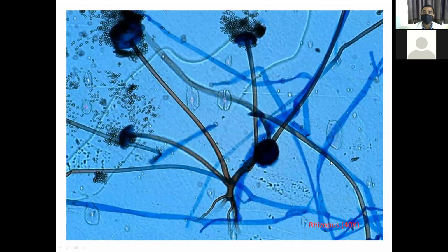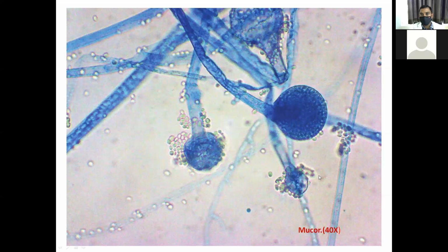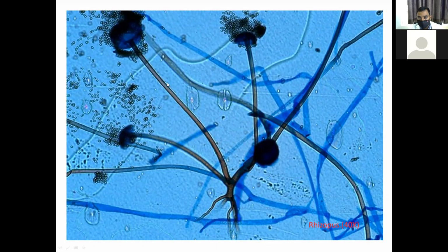This one is Mucor-like, and this one is Rhizopus-like. For Rhizopus also the sporangiophore, with a stalk-like appearance, and sporangia will be seen. But beneath the surface, rhizoids are present. Very clearly you are seeing these rhizoids. See, rhizoids, root-like structures.